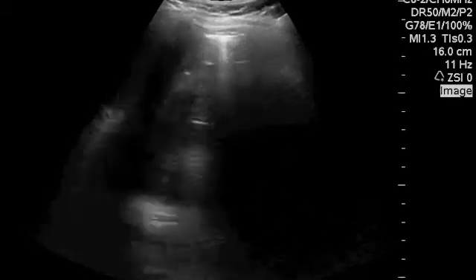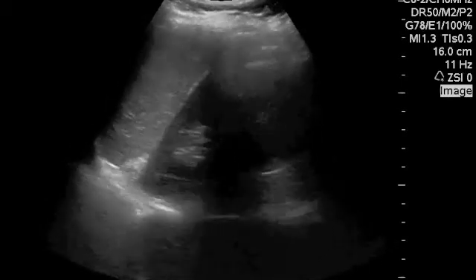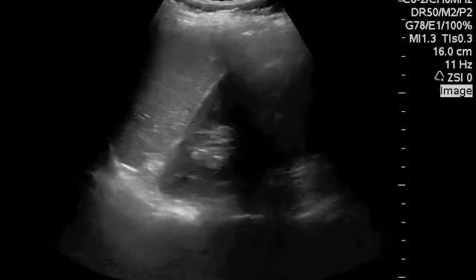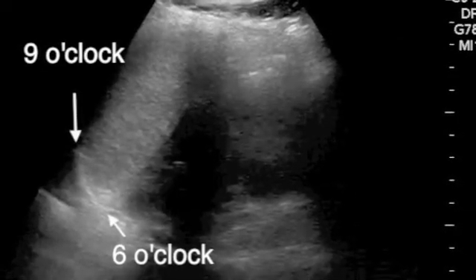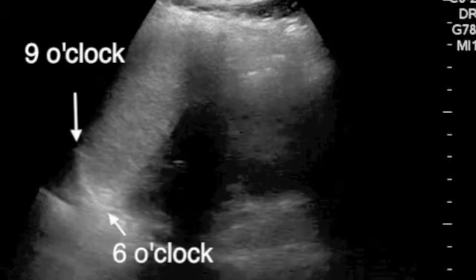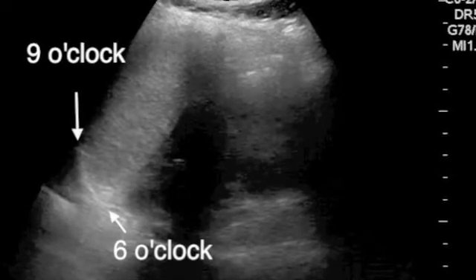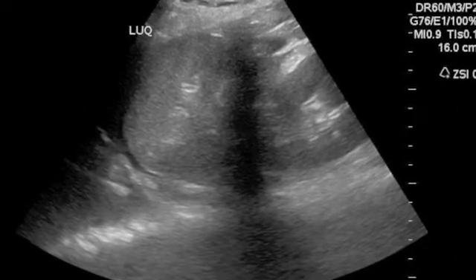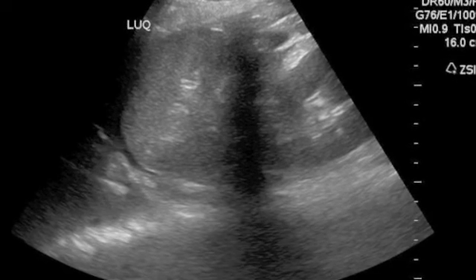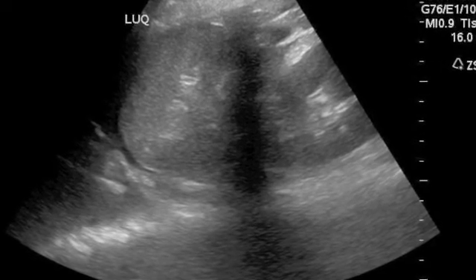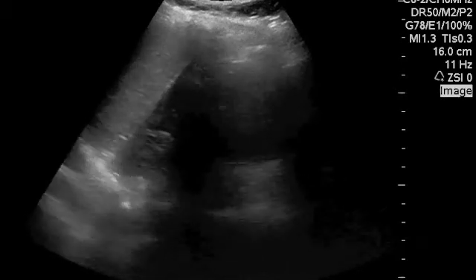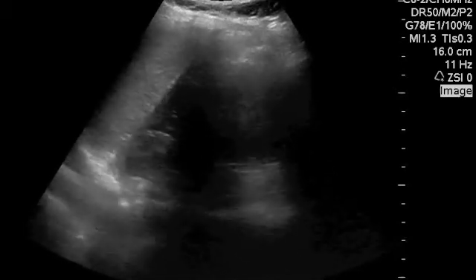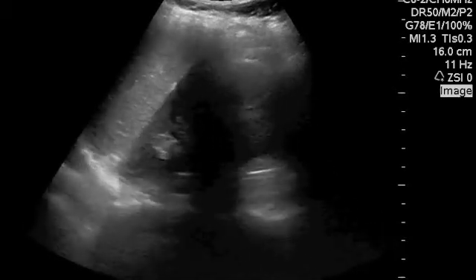Here you'll see the kidney come into view with my AP move — there it is. In the left upper quadrant, it's really important to see the diaphragm from 6 o'clock to 9 o'clock. As you can see in this picture, you often only see the fluid underneath the diaphragm. Here you notice that as the patient breathes, the diaphragm moves in and out of view. You have to be patient.